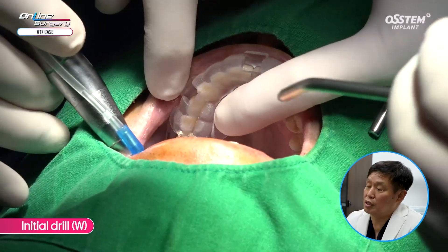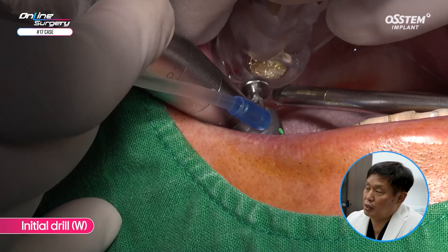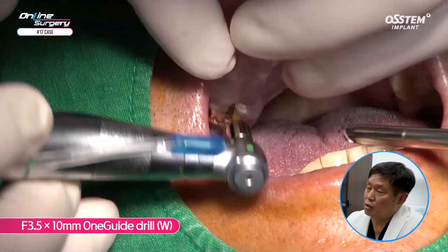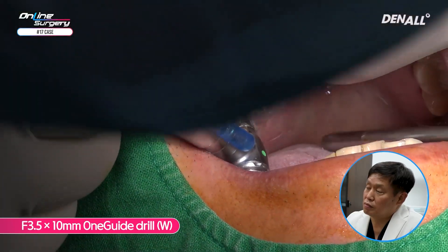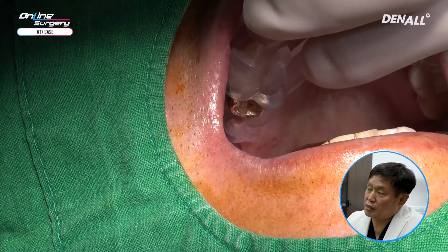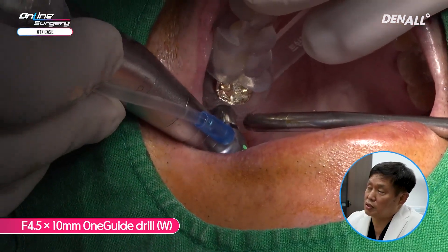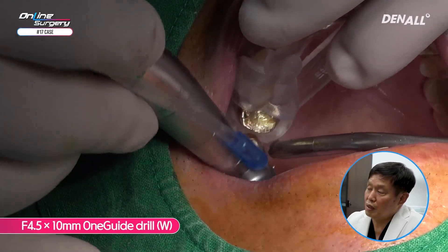Initial drill was used for drilling. Gold rim wide type initial drilling was done. A 3.5 by 10 mm One Guide drill was used. Because this was where socket preservation was done, for the final drill, a 4.5 by 10 mm One Guide drill was used for final drilling.